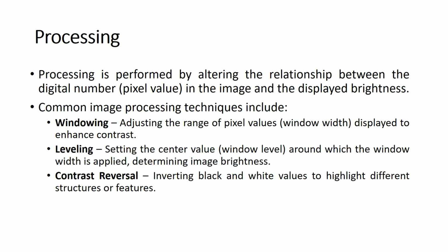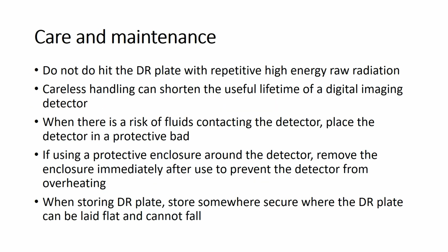Leveling is the setting of the center value, also called the window level, around which the window width is applied, determining the image brightness. Contrast reversal is inverting the black and white values to highlight different structures or features.